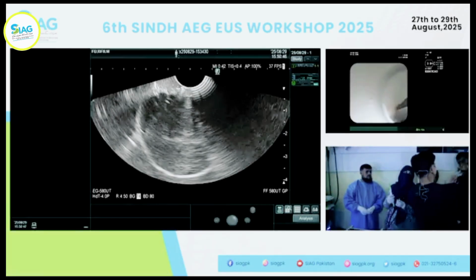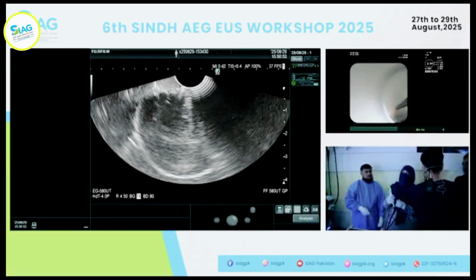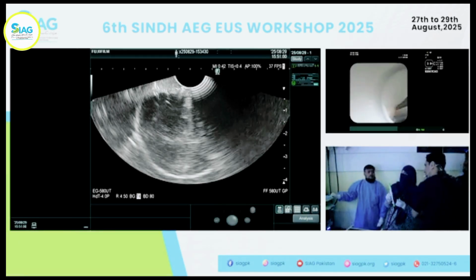Okay, so sometimes you want to take the sheath out, indent it in the mucosa, especially in the stomach. The duodenum is thin, so it shouldn't be a problem. In the stomach, you actually have to bring it out, indent the mucosa a little, and then you go with the needle. So here, bleeding has started to happen as well.